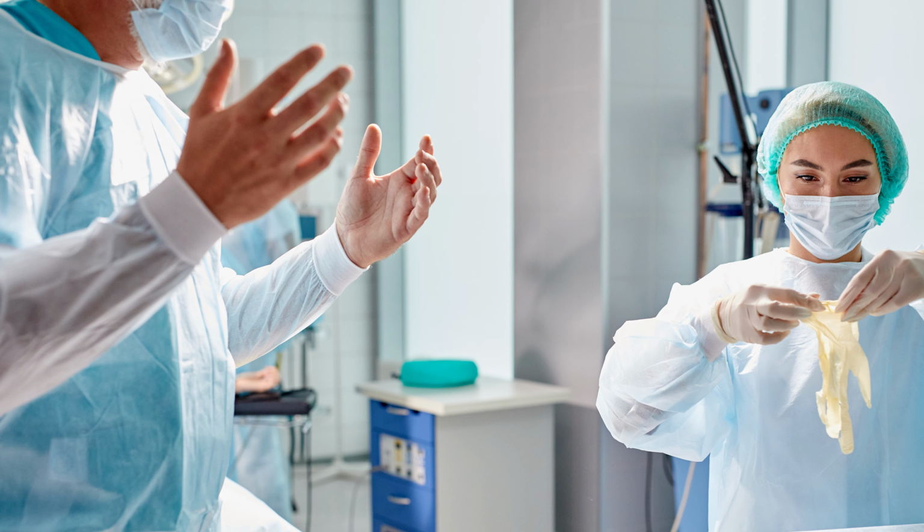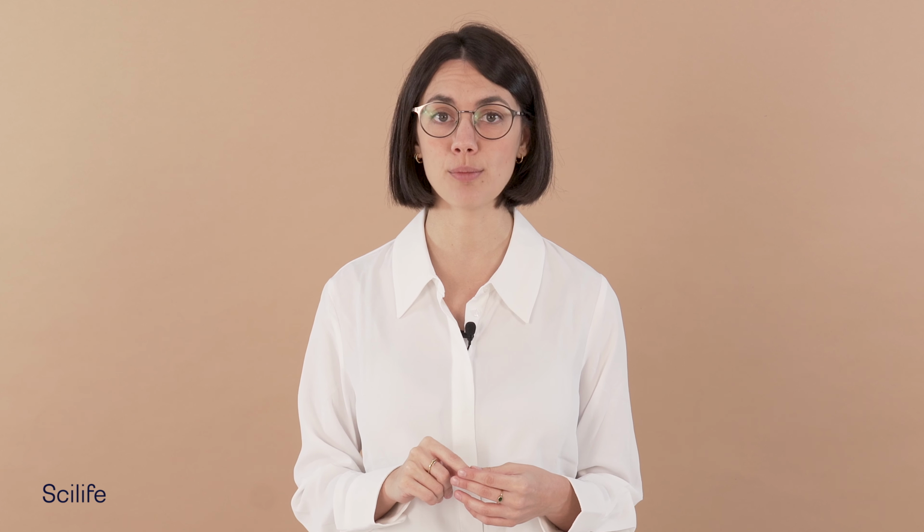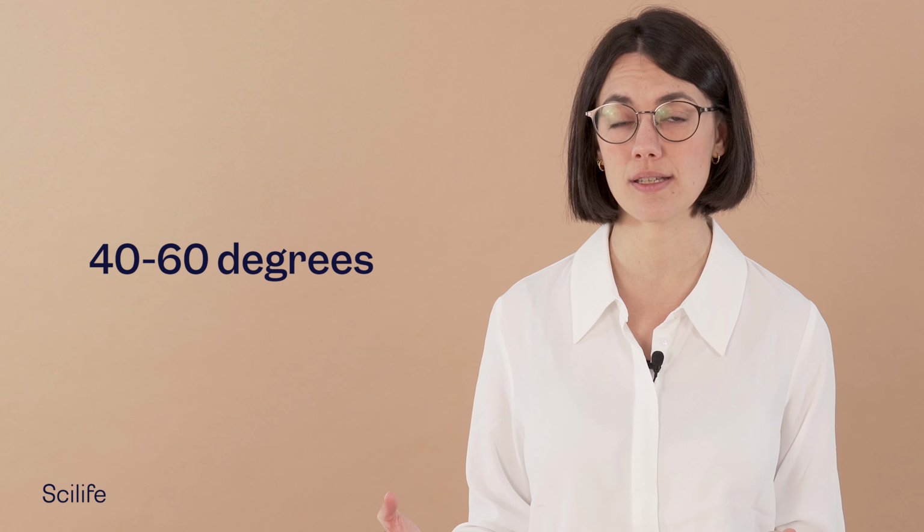The sterilization process requires special measures and care for the protection of workers and patients. It requires a designated area with sophisticated technology and equipment. Employee exposure is limited to 1 part of ethylene oxide per million parts of air, measured as an 8-hour time-weighted average. It has relatively long process times at 40 degrees to 60 degrees Celsius, from hours to days of sterilization.